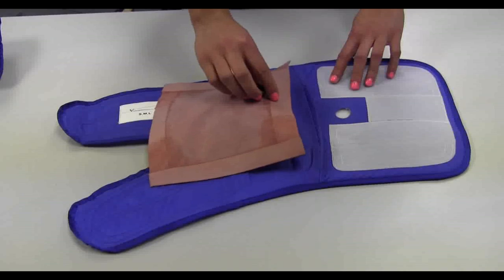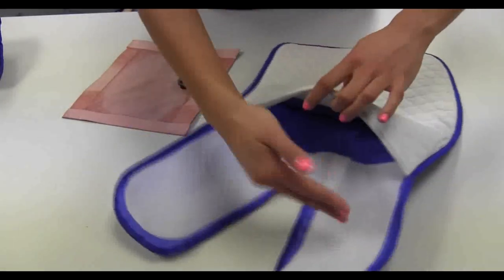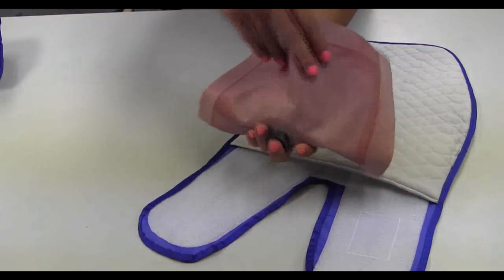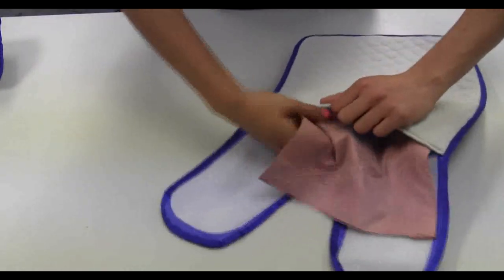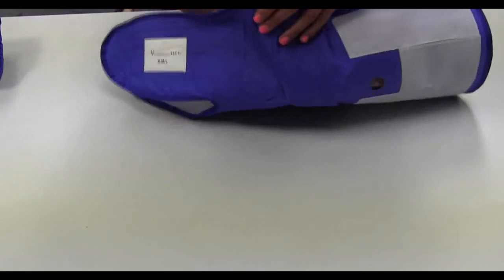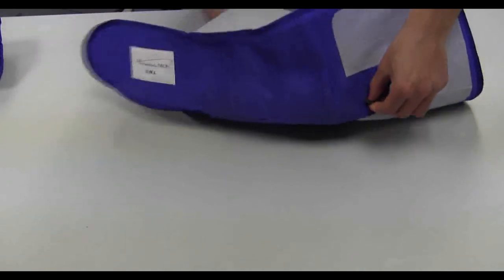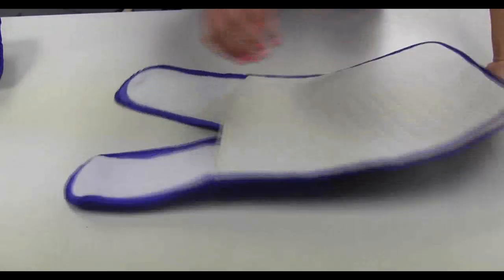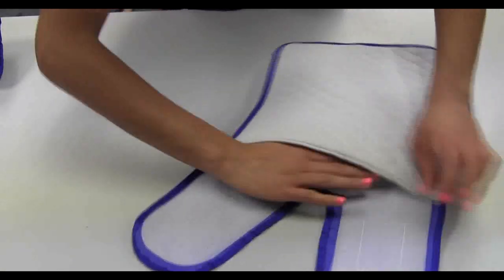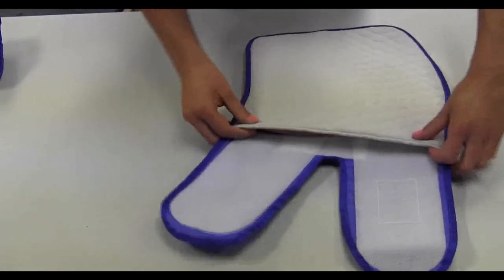Repeat calf cuff assembly for the other calf cuff. Turn the calf cuff over and open the hook and loop binding. Insert the calf cuff bladder inlet first. Push the bladder inlet through the cuff inlet opening. Smooth out all wrinkles and creases, make sure the bladder faces the opening, and close the hook and loop binding.